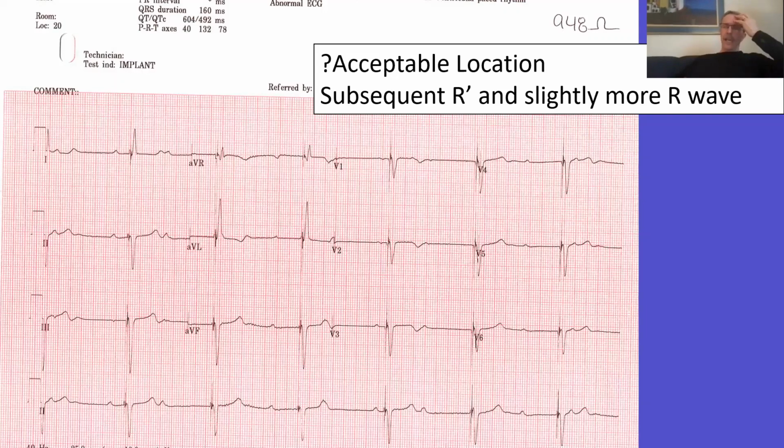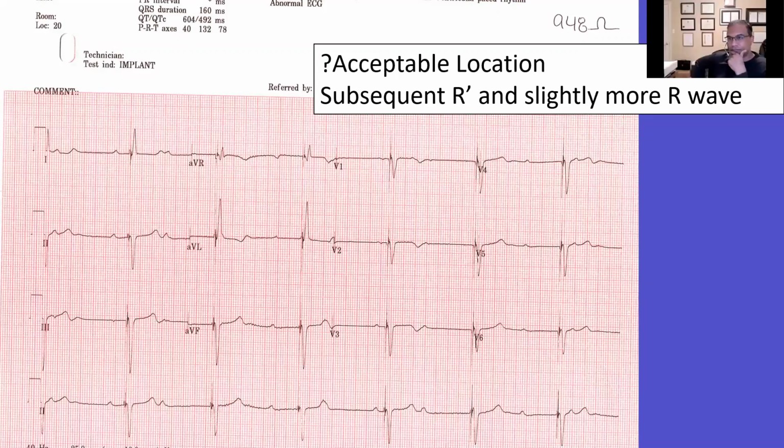Yeah, it is astonishingly narrow, and after spending another, honest to God, 45 minutes or an hour trying to get another, I finally got it. I had a few cases when it happened. Actually, I lost the R prime when I bumped the right bundle. Sometimes, working on the area, you bump the right bundle. A few weeks ago I got curious, because after I bumped the right bundle, my R prime was no longer available, so I had this type of QRS. I thought maybe because the right bundle has been bumped, there's no way to have that morphology, but I don't know. Interesting. Yeah, the R prime didn't bother me, because as you say, you do see that. But anyway, interesting.